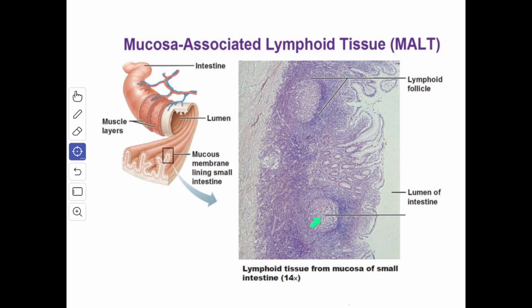The germinal centers may be present, and then you have the diffuse lymphoid tissue, which is termed the parafollicular zone, present in the interval between the nodules. The nodules contain predominantly B lymphocytes, whereas the diffuse area contains T lymphocytes. These masses of lymphoid tissue are present in very close relationship to the lining epithelium of the mucosa in the region concerned, and they lie in the substantia propria.